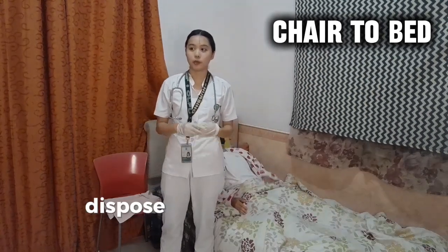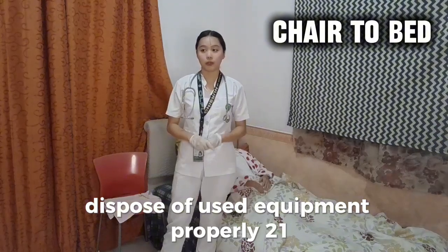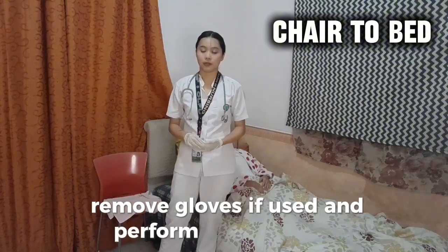Clean and store or dispose of used equipment properly. 21. Remove gloves if used and perform hand hygiene.